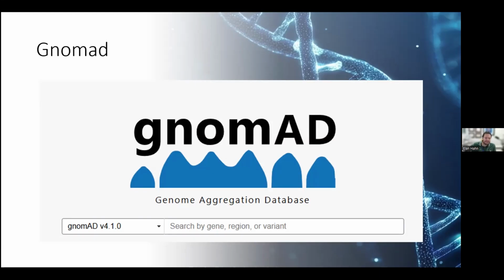There are caveats: insertions and deletions may be underrepresented, partially due to technical challenges associated with their detection. Also, due to clonal hematopoiesis, some variants in gnomAD may actually be somatic and not germline, and when they're in specific genes that are known to be involved in clonal hematopoiesis, it's important to be aware of this phenomenon. You could also examine the read data in gnomAD in their variant report page for very low variant allele frequency variants to maybe help identify what could be caused by clonal hematopoiesis.